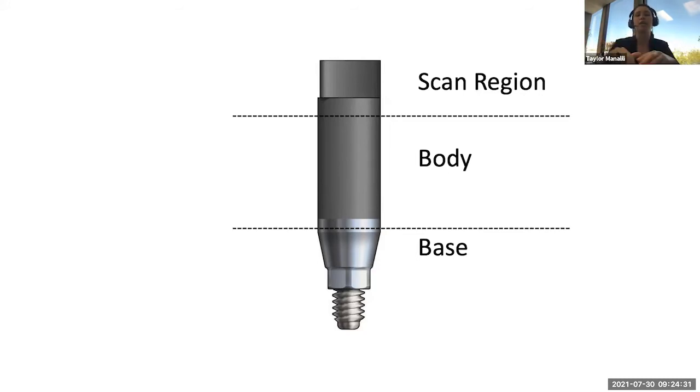That's how they're going to take the digital impression and how they're going to align it in their software so they know the orientation of that implant in the bone, where it is in space, right? Not only in an apical-coronal direction, but exactly where those threads are if they need to put an engaging abutment in that implant. So if we're doing a single unit screw retained implant, which is a majority of the cases that we get in this lab that are scanned in, we do single unit screw retained restorations. If we don't have a crystal clear image of that, we are lost as to where that connection lies. What is that orientation? What is the timing of that implant?